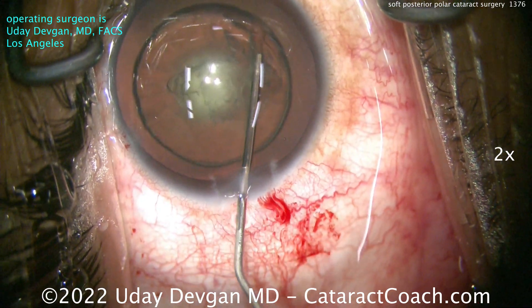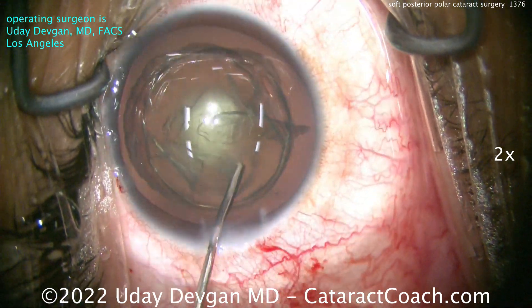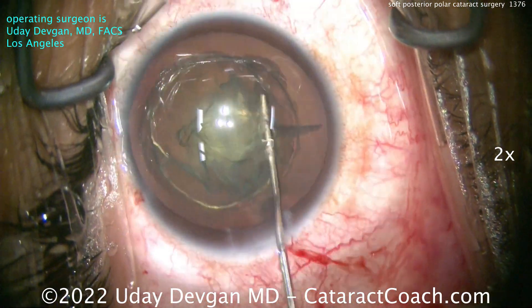Now I'm going to do a little hydro delineation. There's the golden ring — look at that. And let's get that endonucleus up and out of the bag.